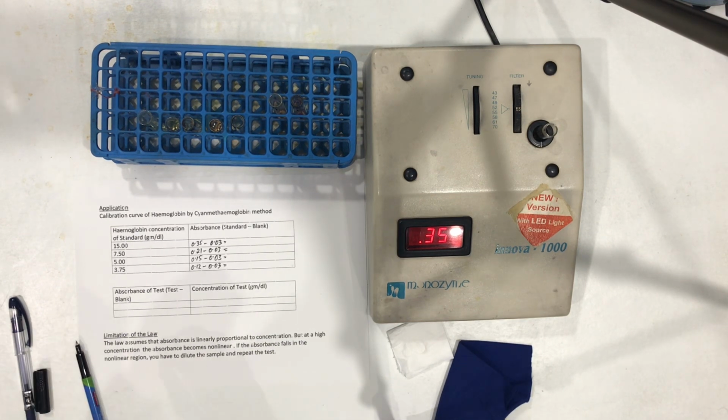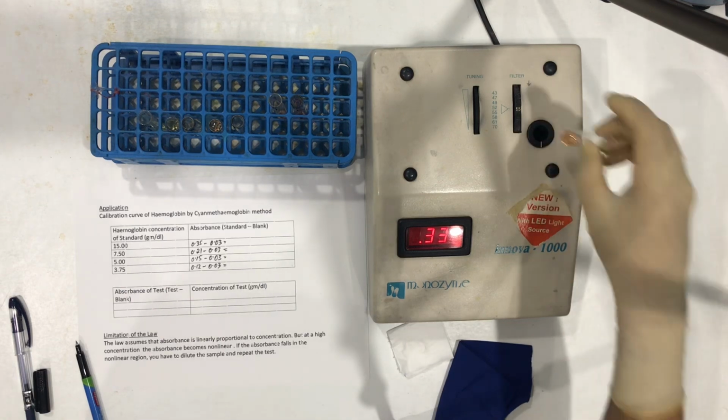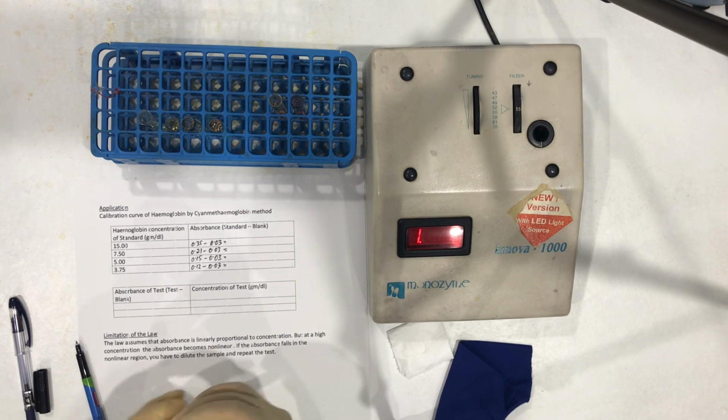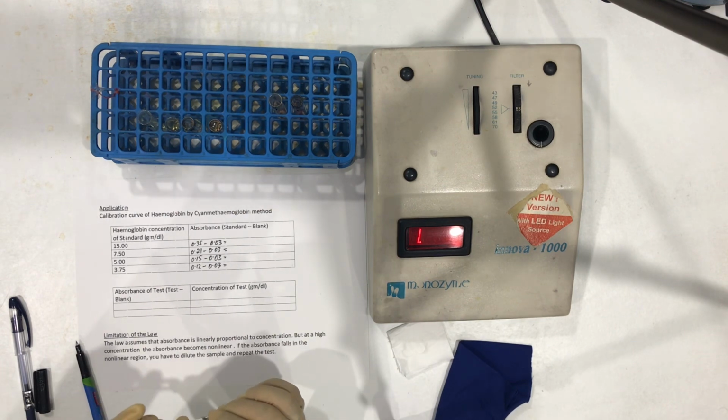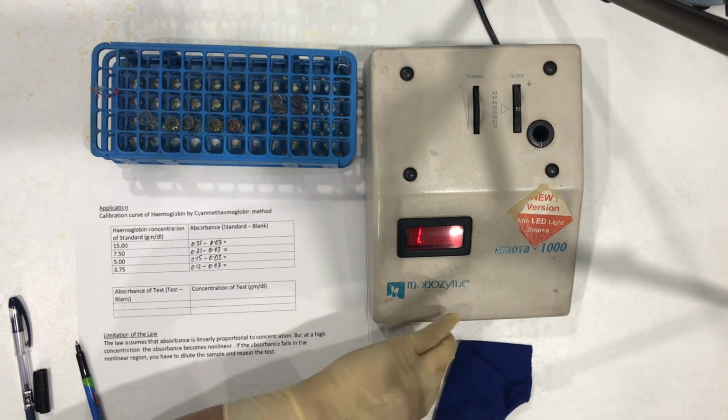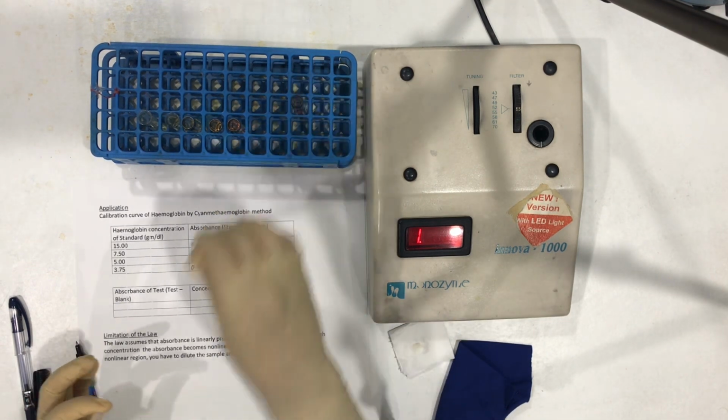Now let us take the absorbance of our sample.